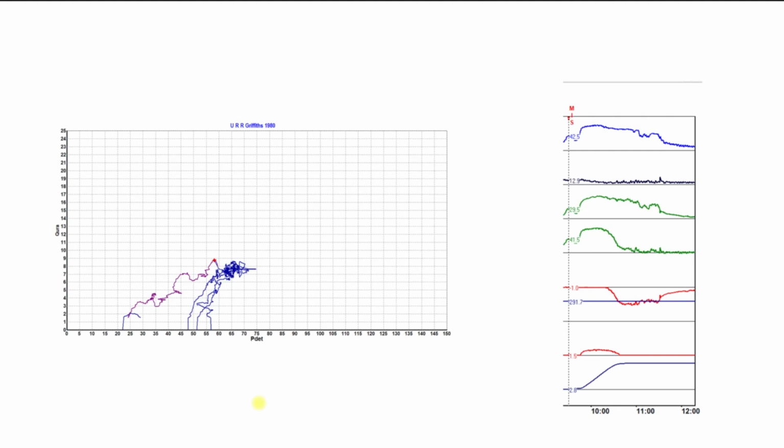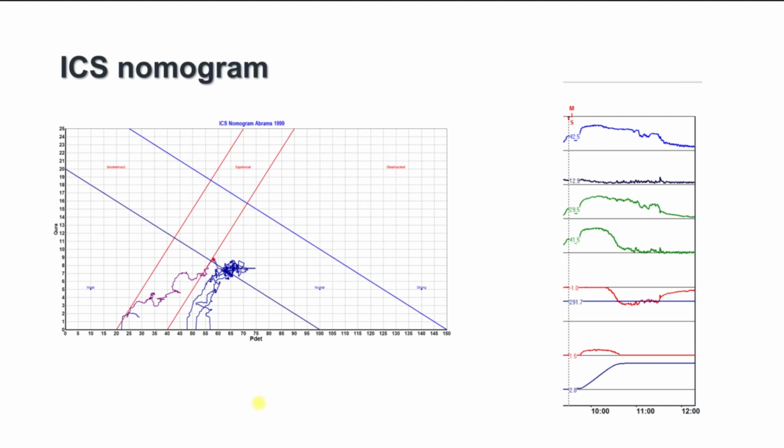Now, if we were to analyze this point in a graph, we would go for either an ICS nomogram, which represents both situations, that is detrusor contractility as well as the presence of obstruction, in one single graph. We'll see how. This P det Qmax point is here as a red dot. We can see these vertical lines from left to right.